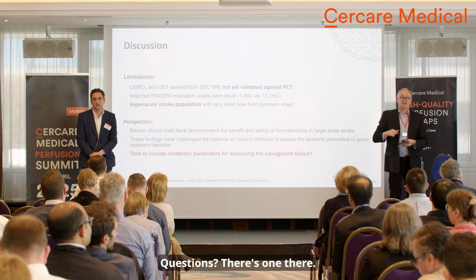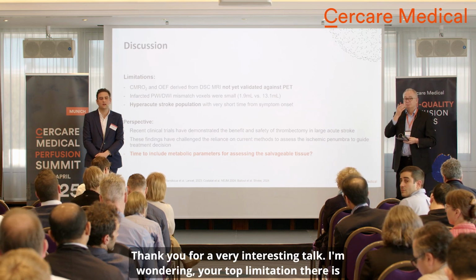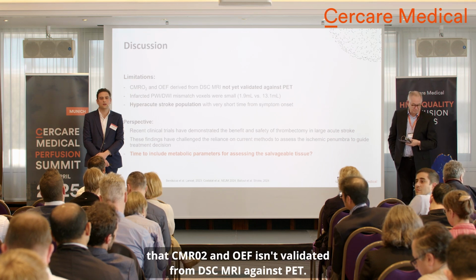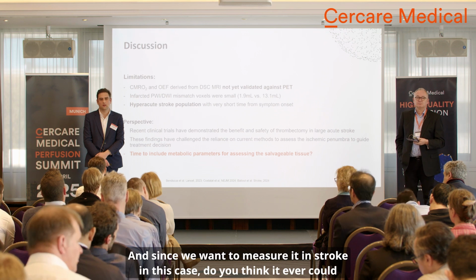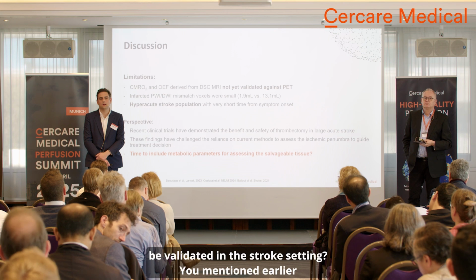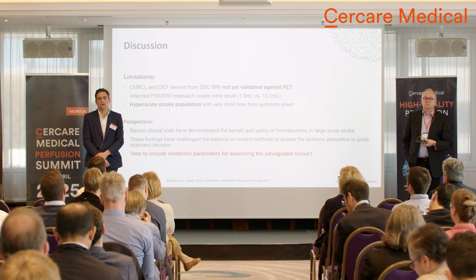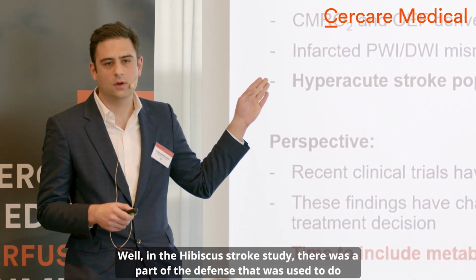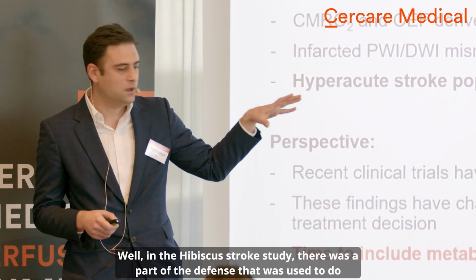Questions? There's one there. Thank you for a very interesting talk. I'm wondering, your top limitation there is that CMRO2 and OEF isn't validated from DSC MRI against PET. And since we want to measure it in stroke in this case, do you think it ever could be validated? You mentioned earlier that it's unfeasible in the stroke setting, and if not, how would you do that?